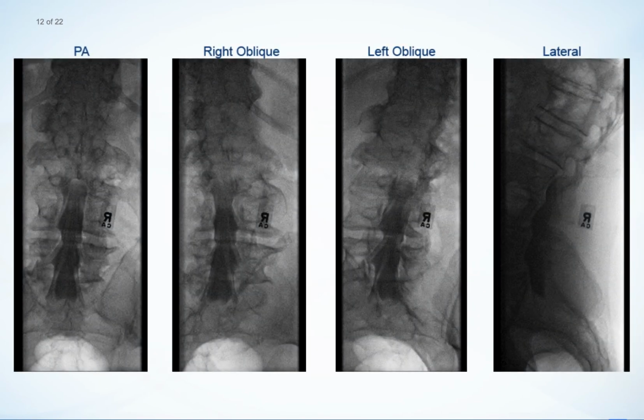After injecting contrast, begin a lumbar myelogram by confirming the column of contrast has spread throughout the lumbar region. Obtain posterior-anterior or PA images, both obliques, and cross-table lateral images. Standing flexion and extension views may also be performed. Images can be obtained either by digital fluoroscopy, routine imaging techniques, or a combination of both.